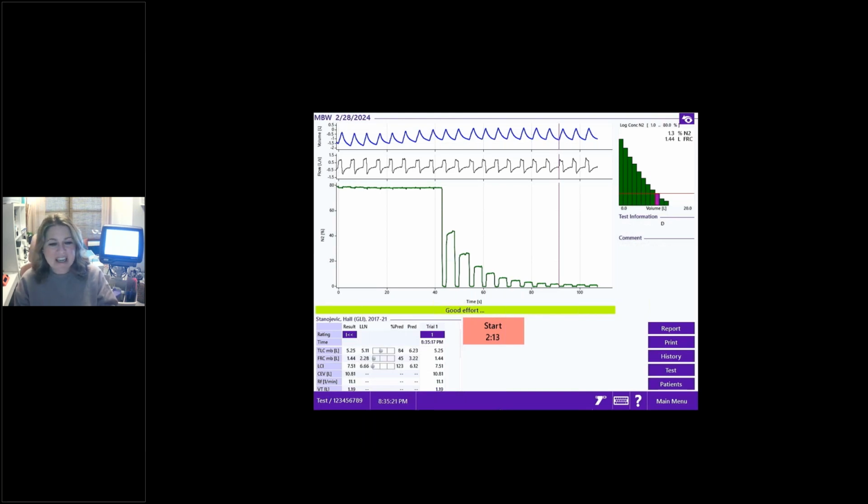All right. So again, I washed out in a little over 100 seconds. So some people will be short like that. Other people, it will take that 7 minutes to wash out, which is why coaching them through that relaxed breathing is so important.